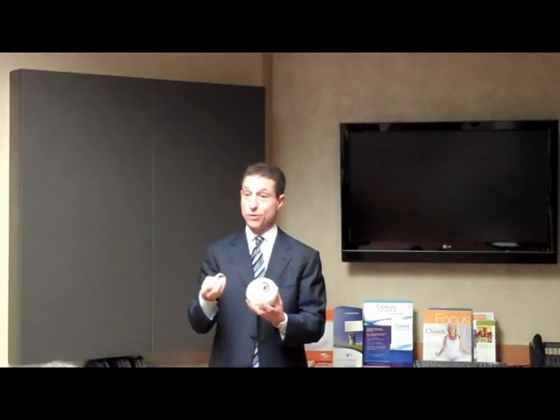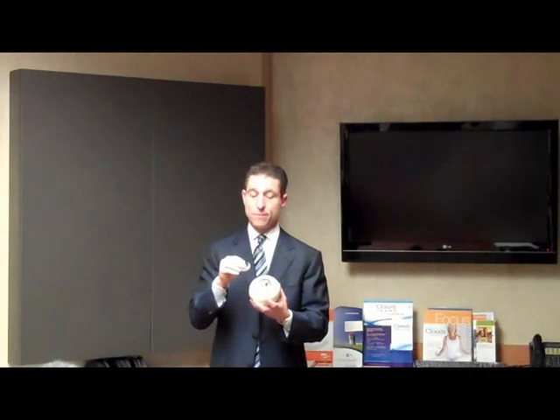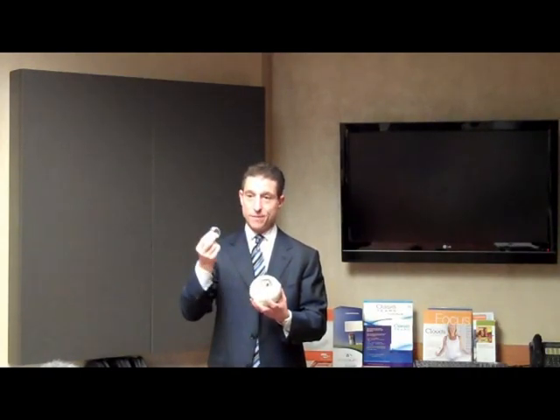Once the cataract is out, we need to put the implant in the eye. Implants have different styles and shapes made out of plastics and silicones, but they're all the same size — because everyone's sac and cataract is the same size. What they differ in is the strength, because some of you are nearsighted and some are farsighted, some have long eyes, some have short eyes — we've measured that back in the office. We try to pick an implant that will get your prescription close to where you won't need an eyeglass to function.